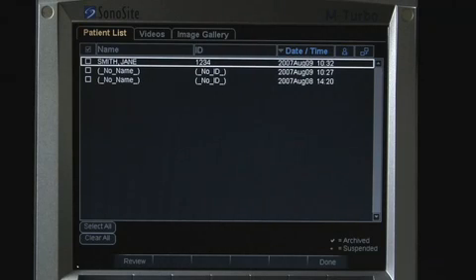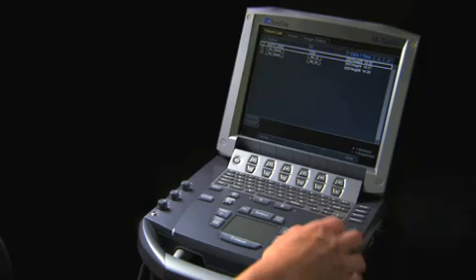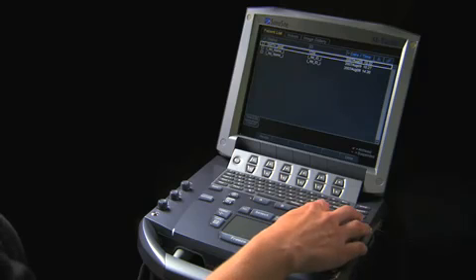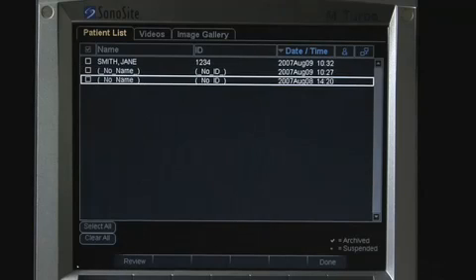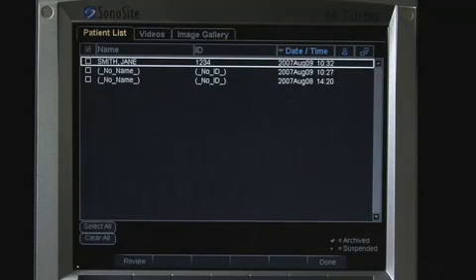To review a patient exam, use the up and down arrows to select a patient exam from the list. The exam highlighted in white is active.